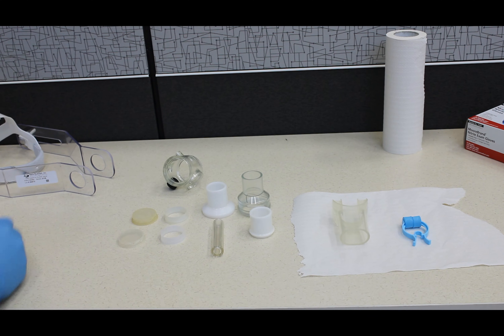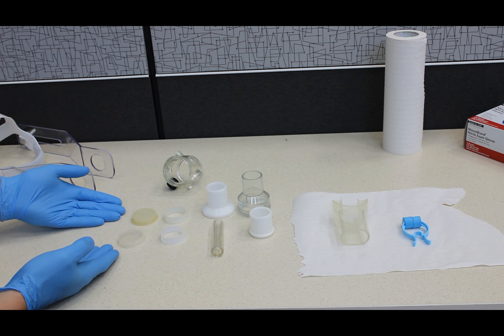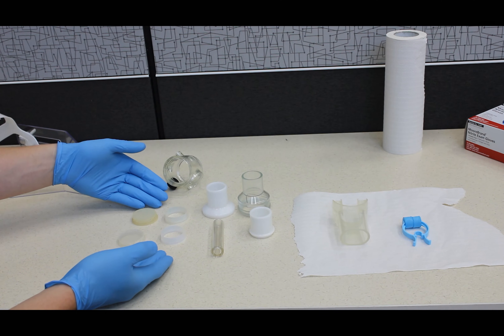Welcome to the VO2max module. In this video, you will learn how to assemble the headgear and prepare the participant for metabolic testing.